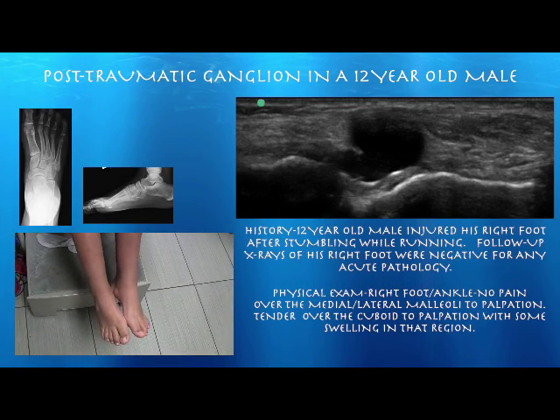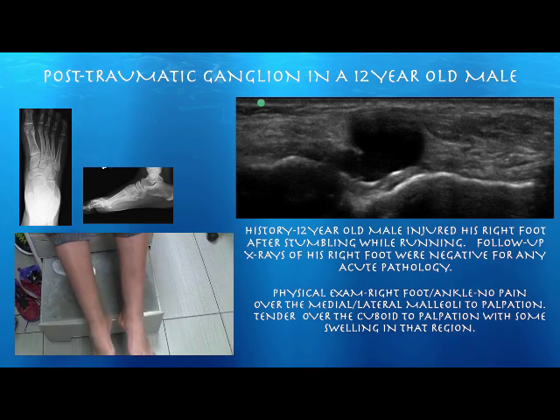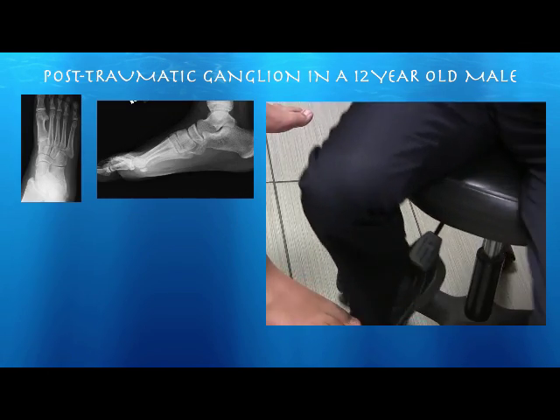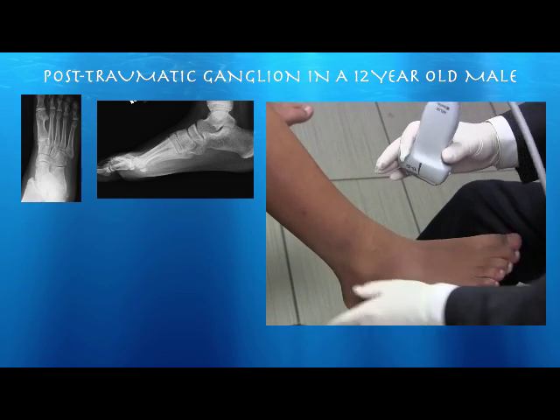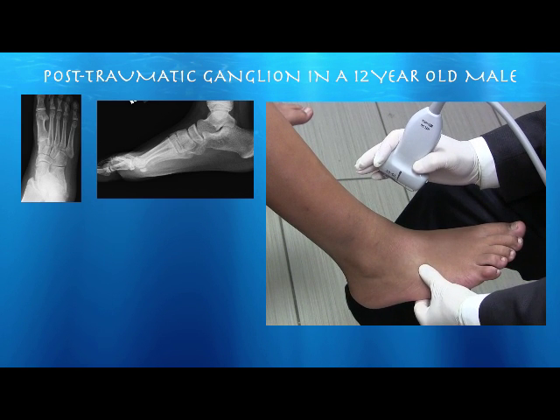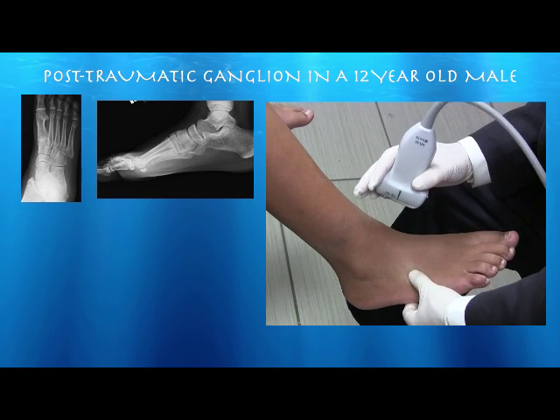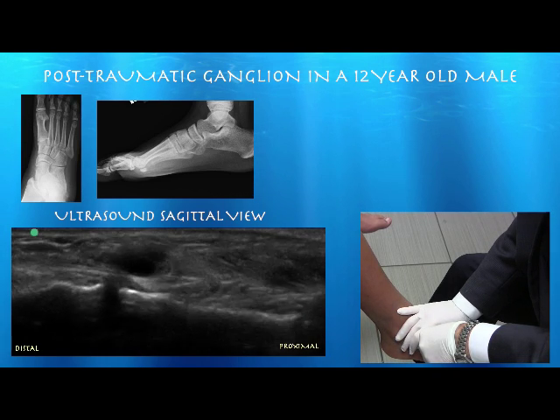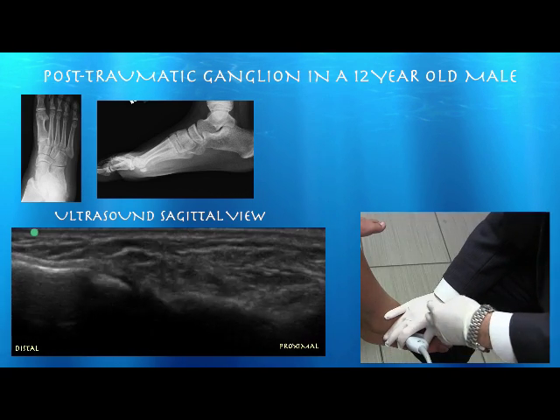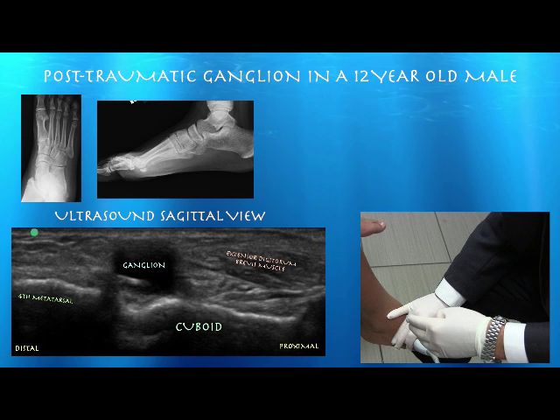This 12-year-old boy twisted his foot about one month ago and has pain right over the cuboid with a little bump there. X-ray didn't show much and it feels like it may be a ganglion. We go ahead and put the probe right over the bump — kind of reassuring as he was concerned maybe a bone was sticking out. Here in the ultrasound the cuboid is on the right side of the screen and the fourth metatarsal is on the left. You can easily see a ganglion right over the cuboid between that and the fourth metatarsal.